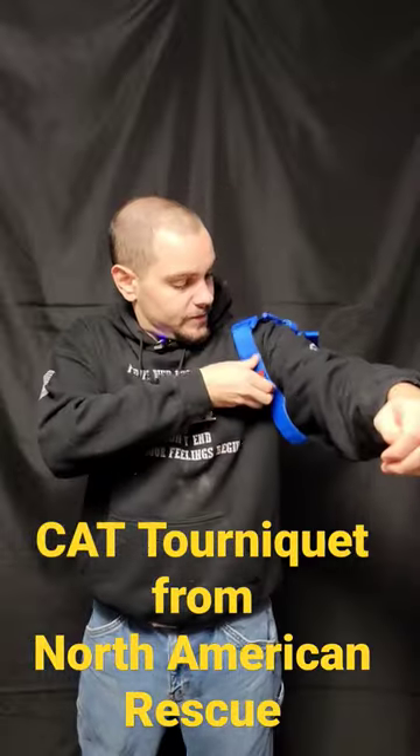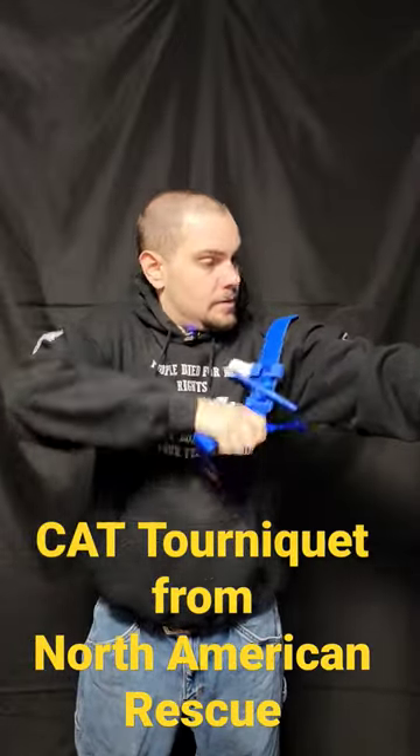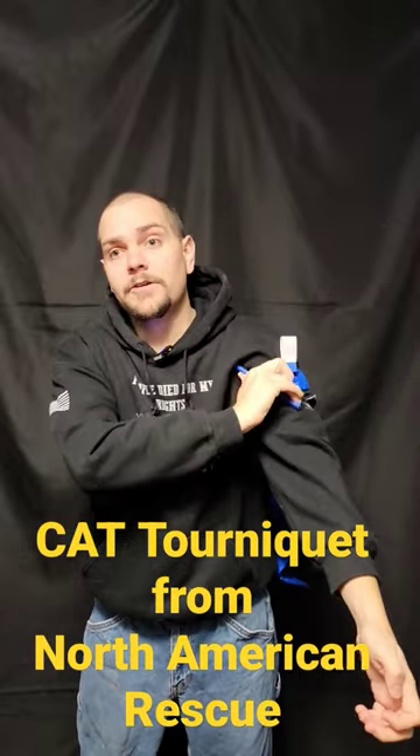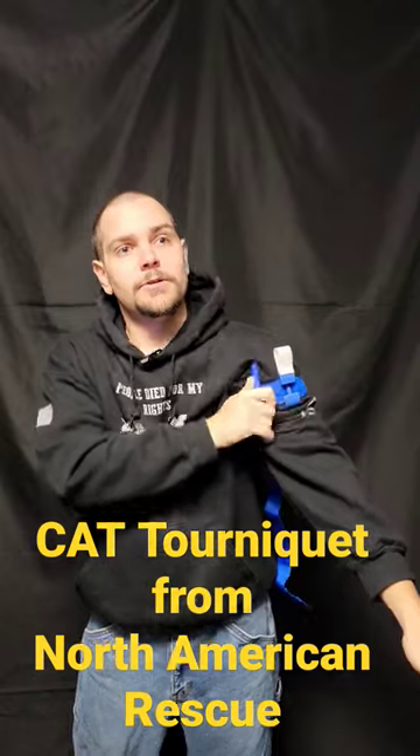So real quick, you're going to deploy these, wrap it over the affected limb, grab the pull tab, pull as tight as you can. Make sure when you're doing this, this tourniquet's as high as you can — because it's either high or die. That's what you got to remember when you're dealing with tourniquets.